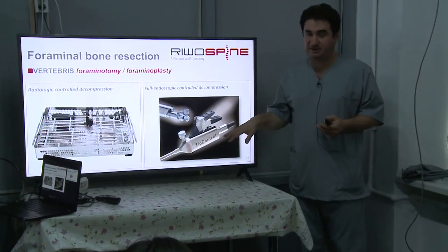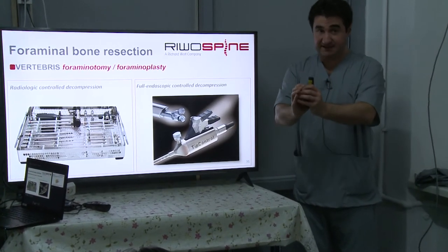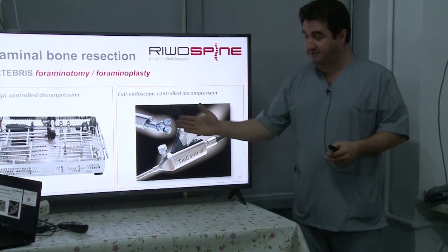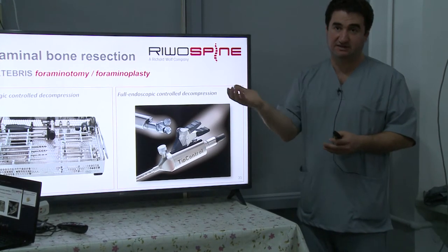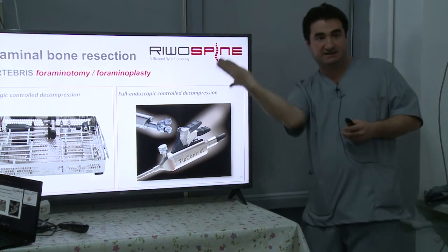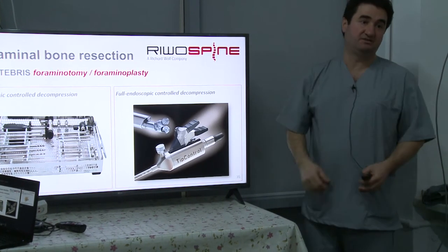And the other possibility, you can start with the extraforaminal approach and with the endoscope, and you can use the tip-controlled deflectable burrs. When you press this one, the tip is deflected like that, and you can easily resect the bone under your visual control.